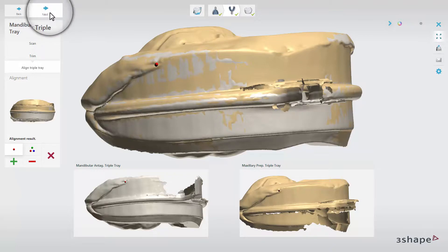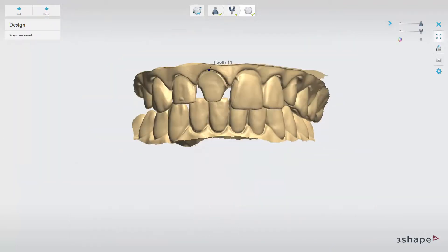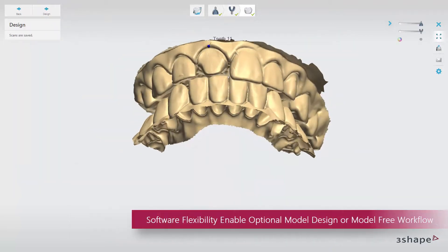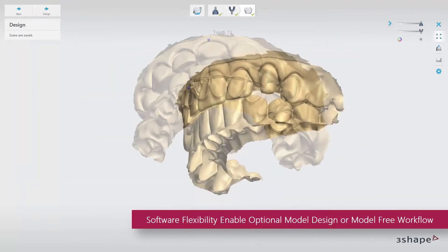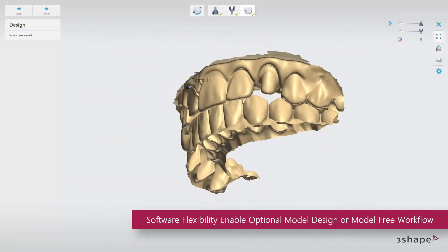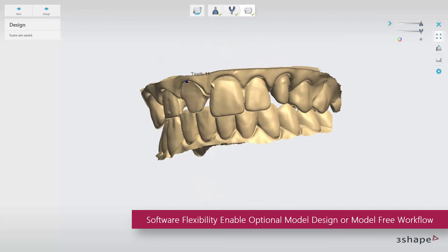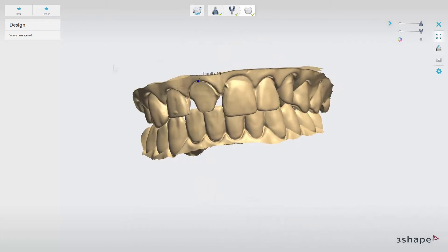When ready, click Next to see the scans in occlusion and save the scans. Now you can click Design to move to Dental Designer.